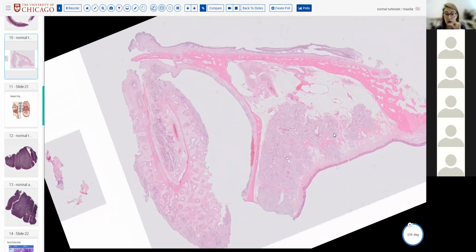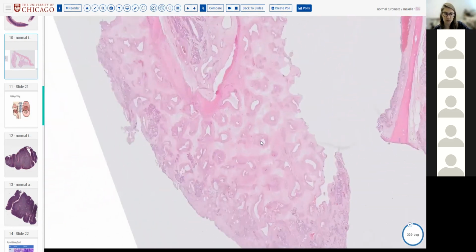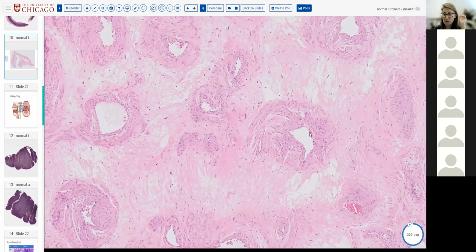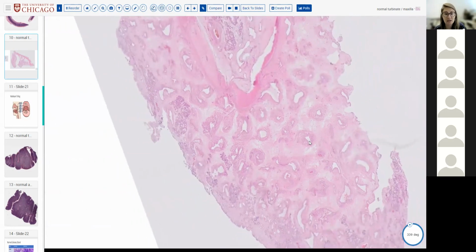We have three compartments shown beautifully here. We have this dangling structure, which has respiratory lining, a core of bone, and thick-walled vessels. It is specifically the turbinate. This is very vessel rich.